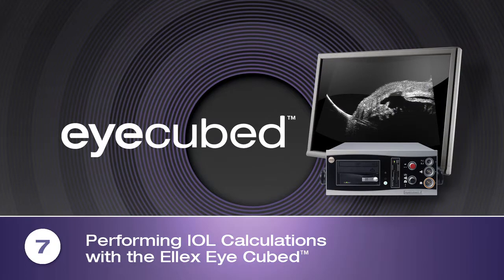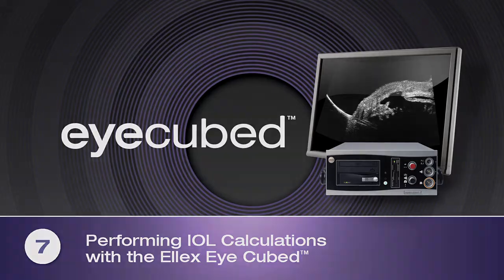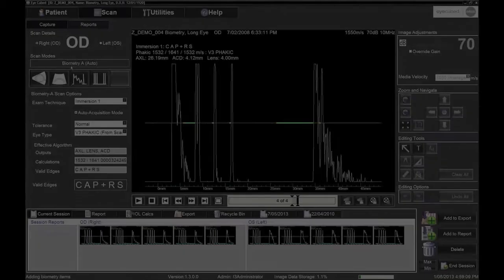Performing IOL Calculations with the AlexiCubed. Performing IOL calculations with the AlexiCubed is easy, fast and accurate.